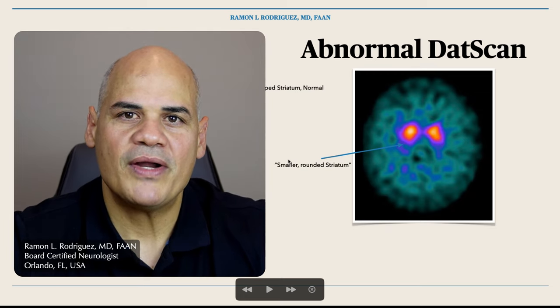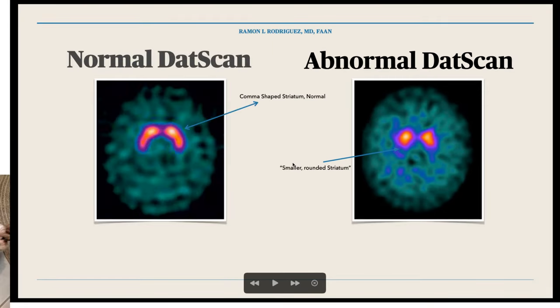Let me show you how a DATScan looks. Right here in the image we have a normal DATScan and an abnormal DATScan. In the normal DATScan, we see this comma-shaped structure — this is the striatum. You see this particular shape and they are quite symmetric, which tells us that the uptake of the contrast in these dopamine neurons seems to be within the normal range. This is what we call a normal DATScan.